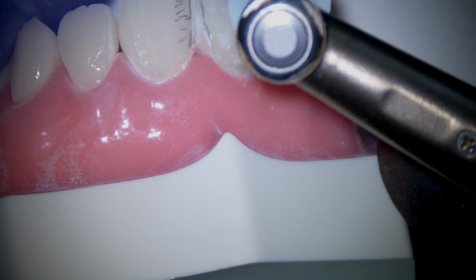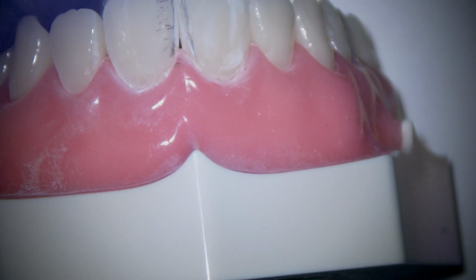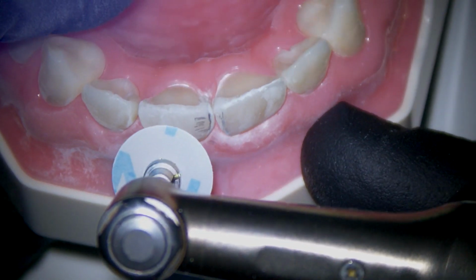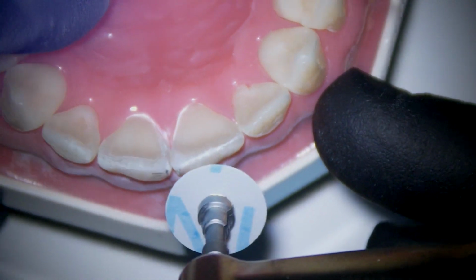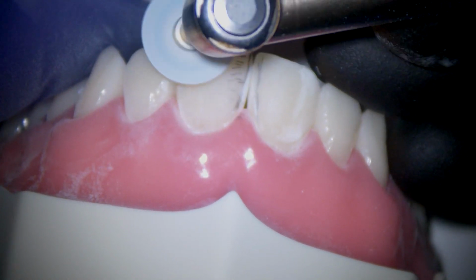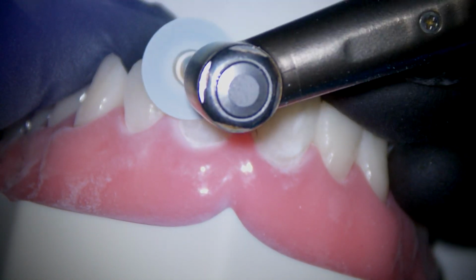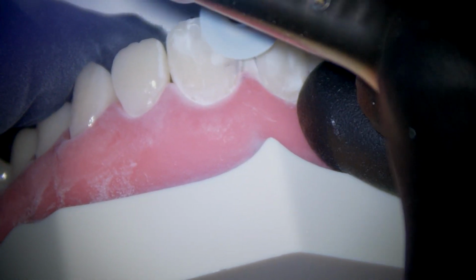And running this disc again around maybe 4,000 to 5,000 RPM until you get that line to disappear. We want to do the same thing on the neighboring central, on the other central incisor. Again, looking from the incisal as we're looking at the contour to make sure that our contours are similar. Running from composite to etched but unprepared tooth structure.